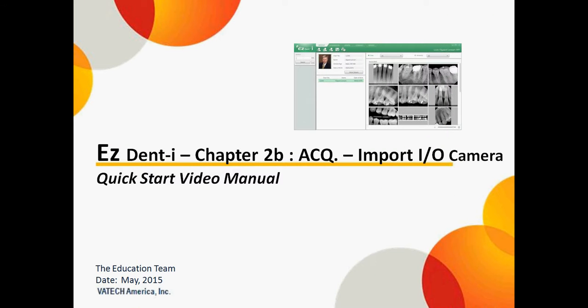Welcome back to the EasyDent Eye Quick Start Video Manual, Chapter 2B, Acquisition, to Import Intraoral Camera Images.